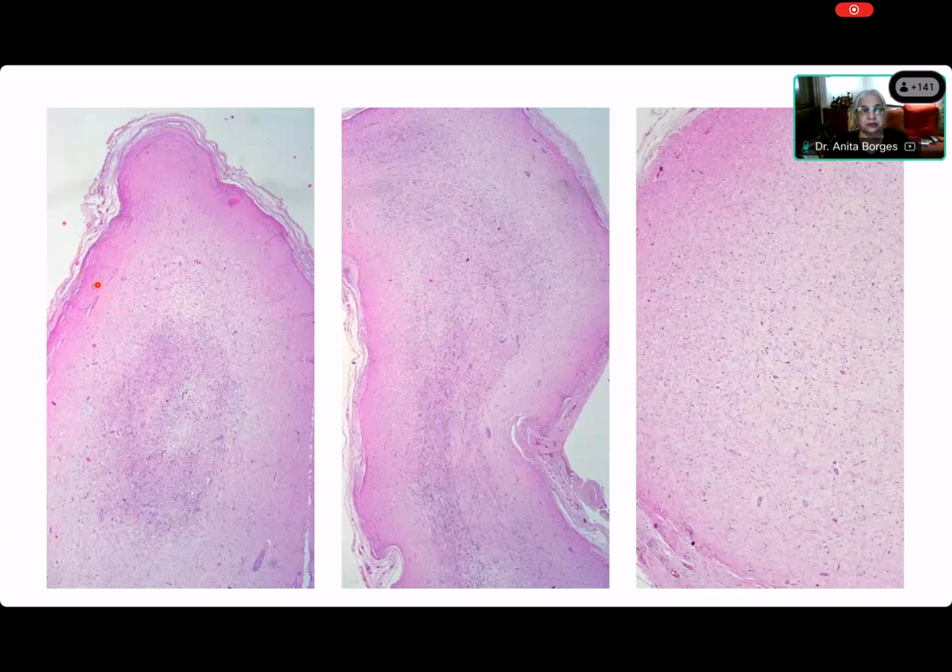You see very dense pink areas, eosinophilic areas at the periphery, which suggest that there must be collagen over there. And as you come towards the center, you see less and less pink until it becomes actually blue. Do you see this or not? Yes, ma'am, I can appreciate it. So that's what has to be appreciated. The pink has become less pink and then it has become blue, which tells you that this lesion has got degrees of collagenization and myxoid change that you can see.